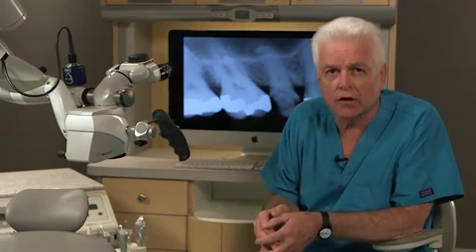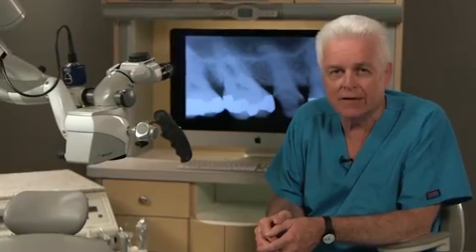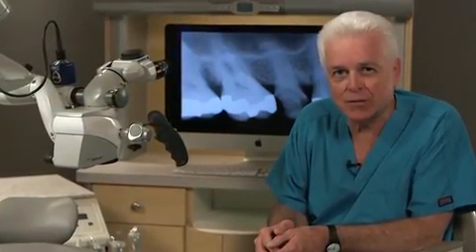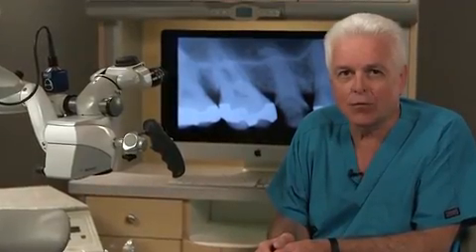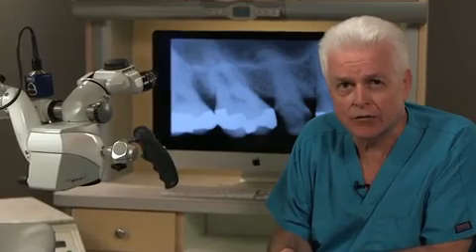My assignment today is to talk about canal preparation. Specifically, I'm going to focus on glide path management and shaping canals. Well-shaped canals promote three-dimensional cleaning and filling of root canal systems. Speaking of glide path management and shaping canals, let's radiographically evaluate this maxillary second bicuspid for endodontic treatment.